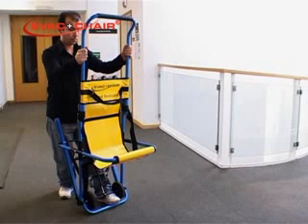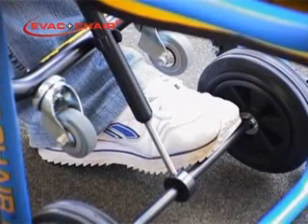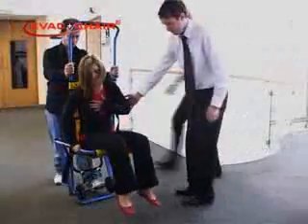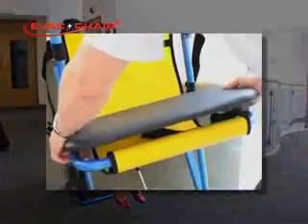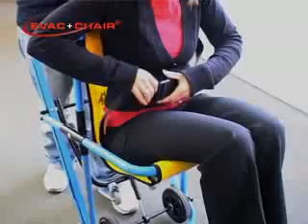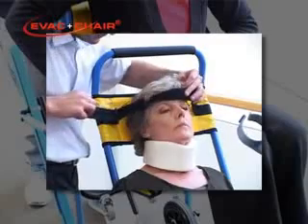You must remain in position behind the evac chair using both uprights of the handle to hold it firmly. Place one foot on the front wheel axle or on the bottom bar as your occupant transfers into the evac chair's seated position. Depending on the condition of the occupant, further assistance may be required with the transfer. The evac chair comfy seat is an accessory to accommodate people with special difficulties, such as back problems or leg fractures. The seat belt must now be fastened and the head restraint used to assist with airway management if required.